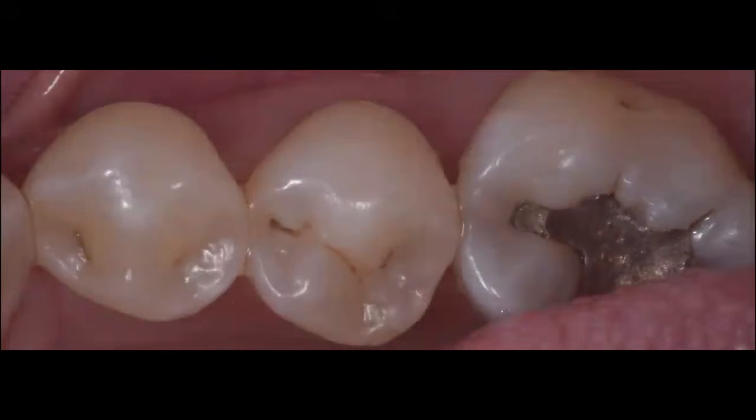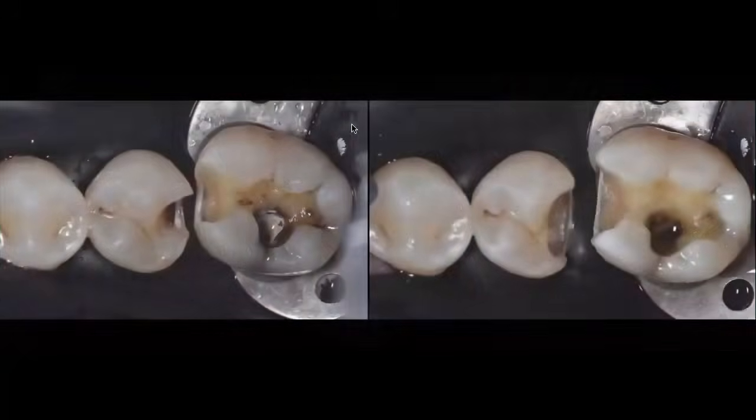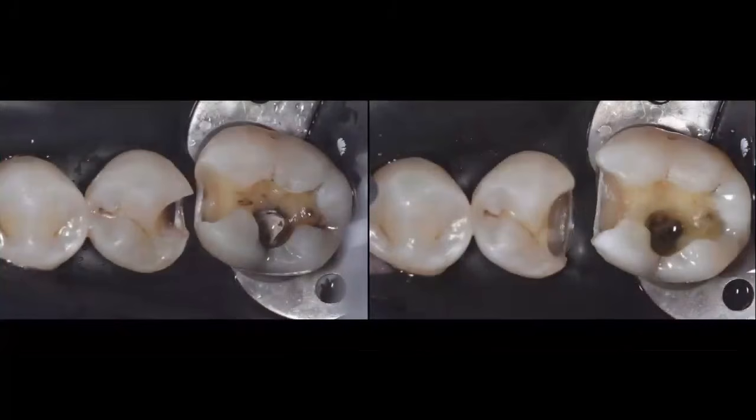And the cases that I presented to you today are very deep and wide proximal boxes. So as you know, these are not easy clinical scenarios. And I'm sharing with you in these clinical scenarios, you can see the photo on the left. I've already accessed my preparation. I've accessed the cavities. And now I'm going to go ahead and remove all the infected dentin and the demineralized enamel using my caries detection dye, so that I can make sure that I end up having a clean peripheral seal zone.